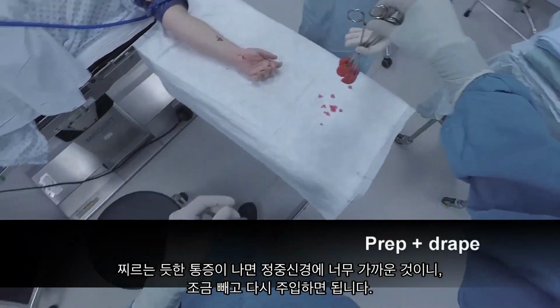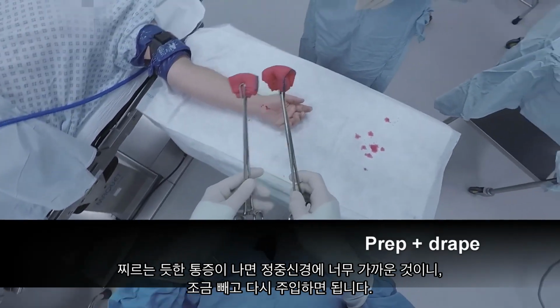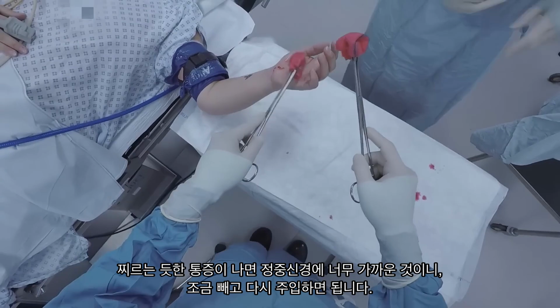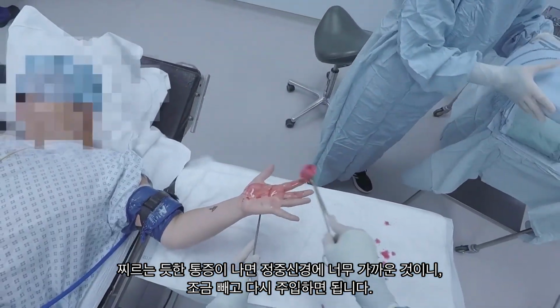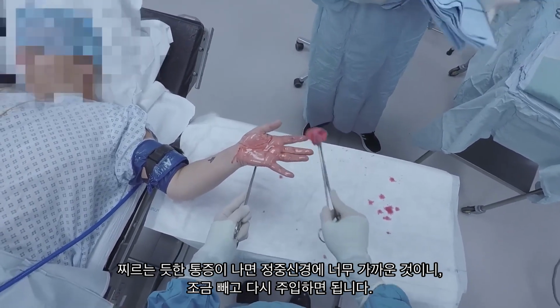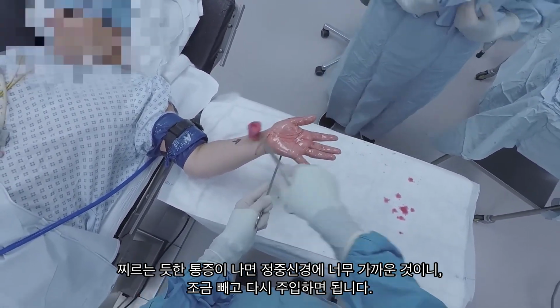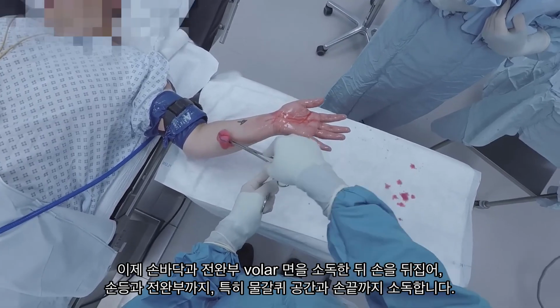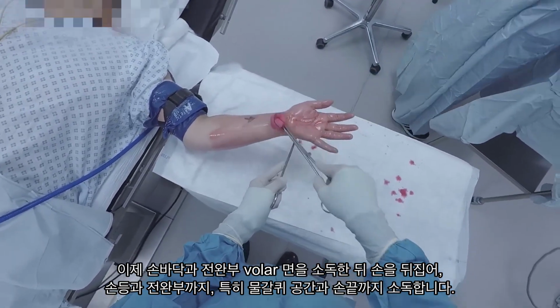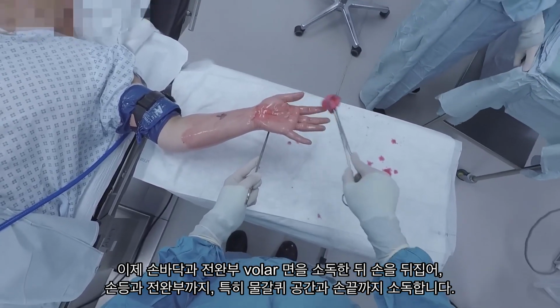This part is relatively straightforward. After you or the theatre staff have put on a tourniquet and you're scrubbed, start to prep the hand. If the patient's awake, they can hold their arm up for you, otherwise an assistant can give you a hand. You'll need 2 sponge holders, generally one used to support the hand and the other to do the painting. If you start with the palm facing up, prep the palm and volar forearm before asking the patient to flip over to paint the dorsum of the hand and forearm.